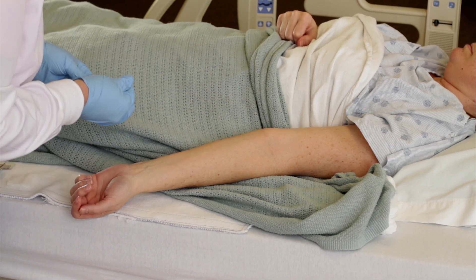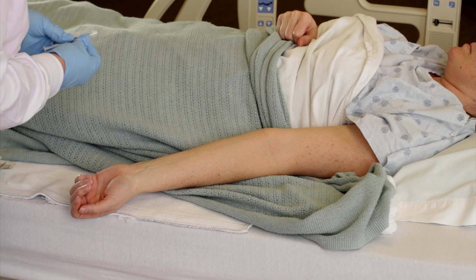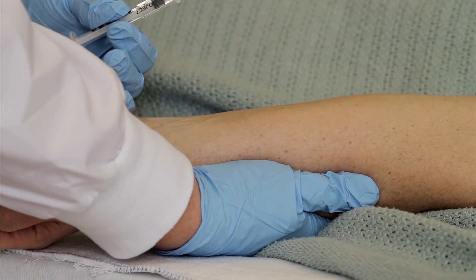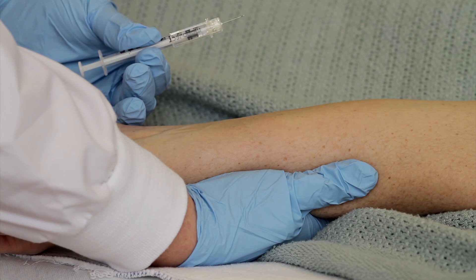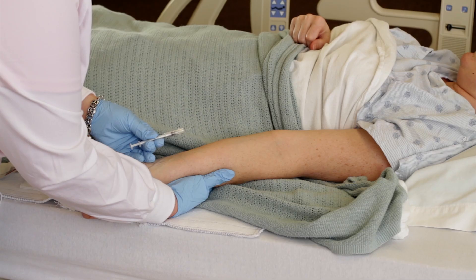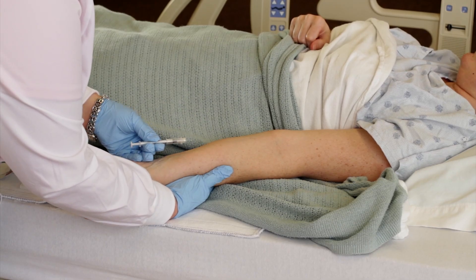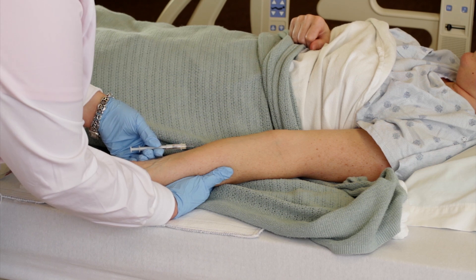Remove the needle cap by pulling it straight up. Hold the skin taut with your non-dominant hand. Hold the syringe in your dominant hand between thumb and forefinger.